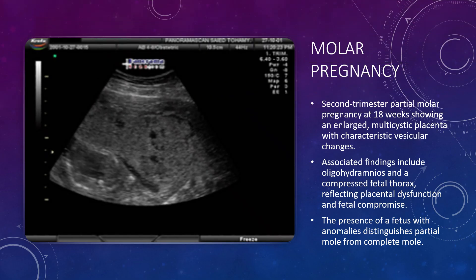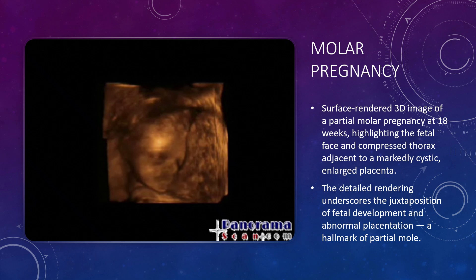Here is a second trimester partial mole pregnancy at 18 weeks. Notice the enlarged multi-cystic placenta with characteristic vesicular changes. We can also see oligohydramnios and a compressed fetal thorax — signs of placental dysfunction and fetal compromise. The key distinction from a complete mole is right here: the presence of a fetus, often with anomalies, alongside the abnormal placenta. A surface-rendered 3D image of the same case clearly shows the fetal face and compressed thorax sitting right next to a markedly cystic enlarged placenta, driving home the hallmark juxtaposition of ongoing fetal development and abnormal placentation.